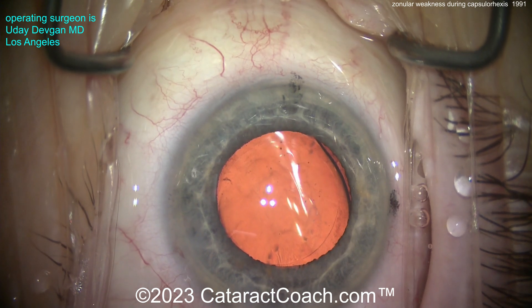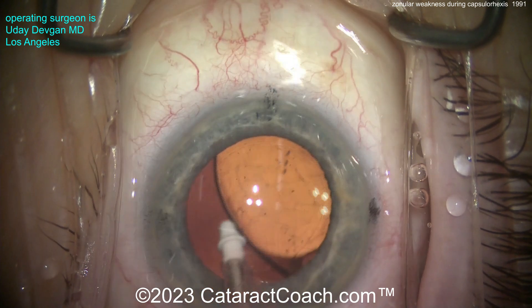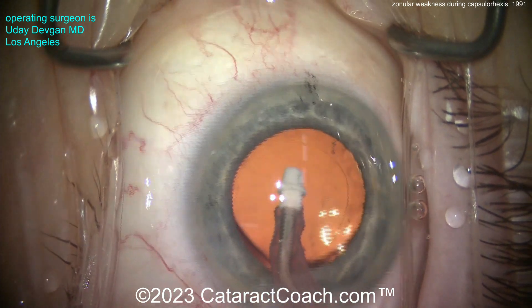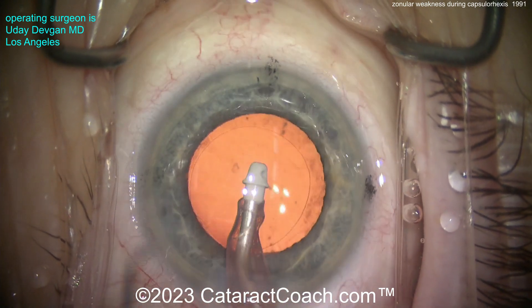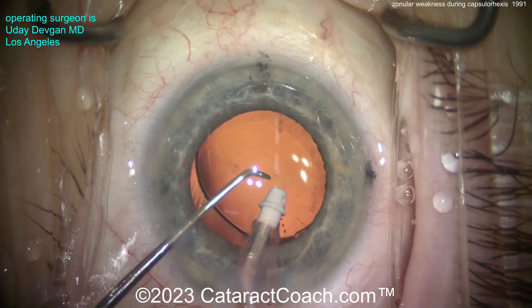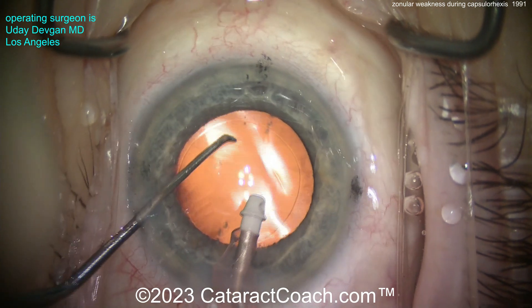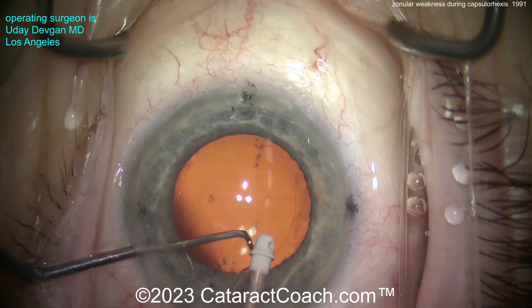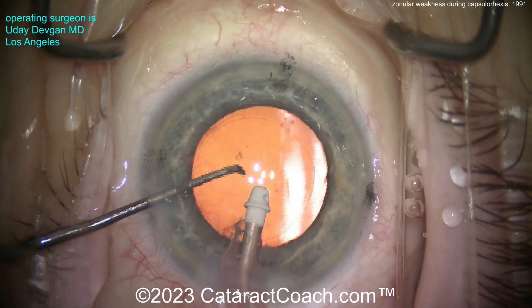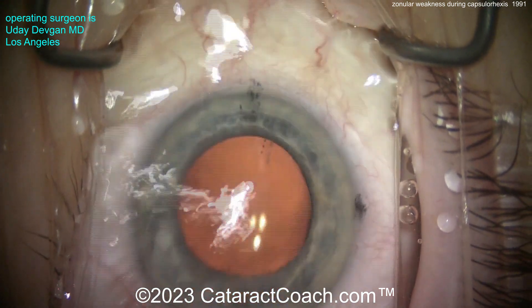One of the reasons I like to do the capsulorhexis with just the forceps — poking in with just the forceps first — is that it's very efficient. I don't need a cystotome for every case, which saves time and money. I also get a very important hint that I would not have otherwise received. If I had used only the cystotome to start this rhexis, I would have gone through this case thinking it's a pretty normal case with normal zonular support — but that's not the case here. So I like the forceps technique because it gives me additional information for every case.